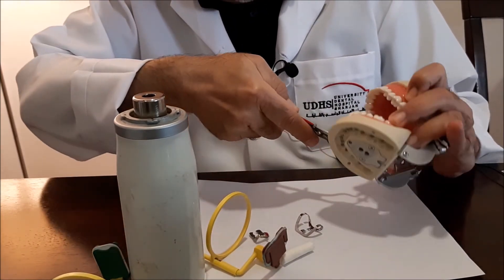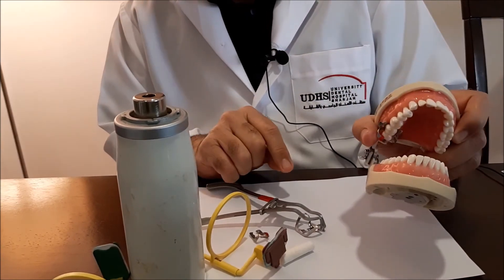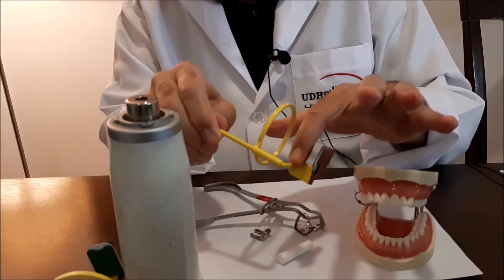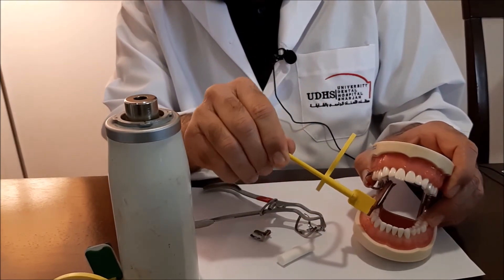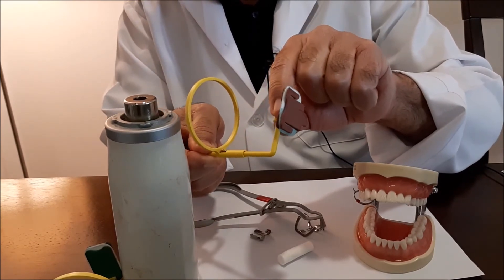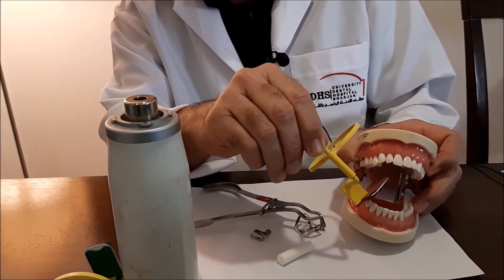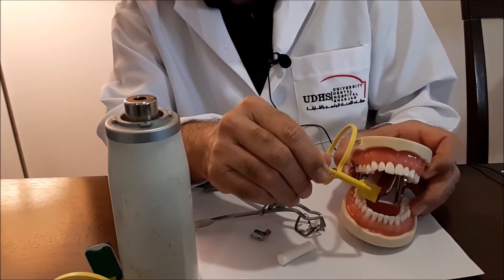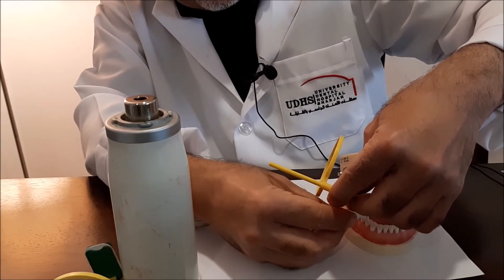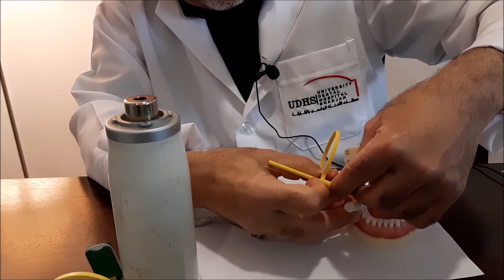For example, when working on an upper second molar, place the clamp over the molar. Since the arm extends outward on this side, you can use it on the upper right. When working on the upper seven, do not place the sensor holder on the seven itself as it will interfere with the reamer. Place it on the upper six instead, and push it all the way inward toward the midline. Then place the cotton roll before asking the patient to close.